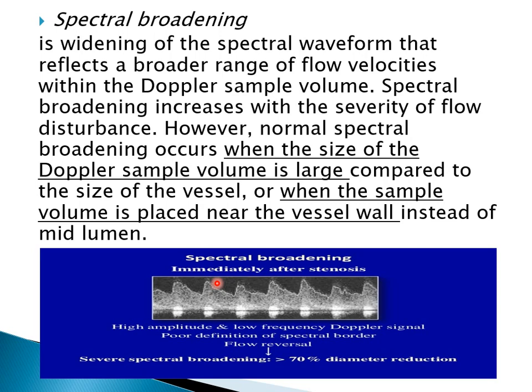Spectral Doppler. You can change it, but usually it is this range of colors between yellow, green, and orange.